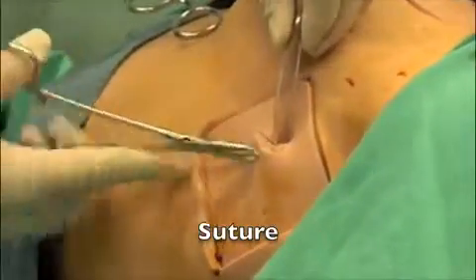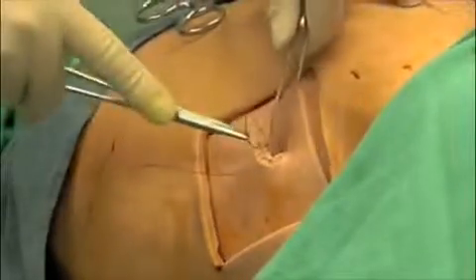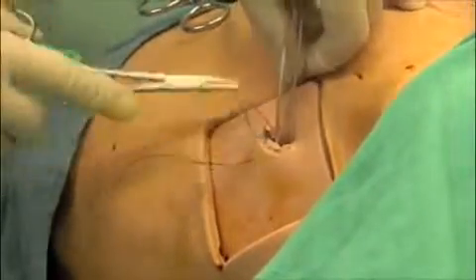To suture the tube to the skin, place the anchor suture across the incision and tie a knot. Next, wrap the suture around the chest tube several times and tie securely.